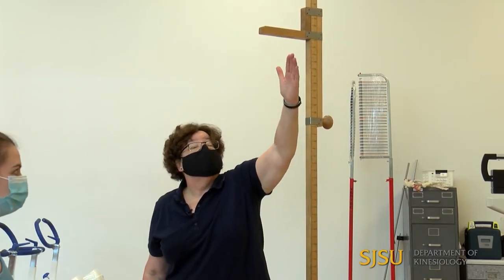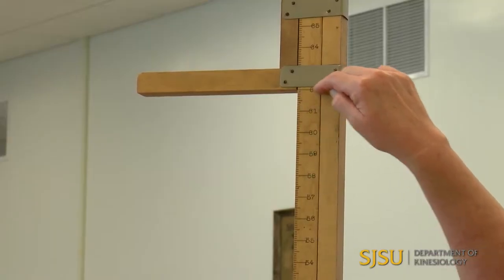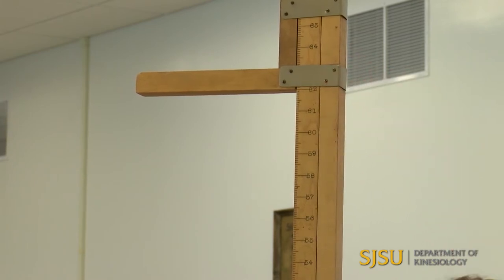From this side I can measure centimeters, and from this side I can measure inches right to this point. As you can see, she's just over 62 inches.